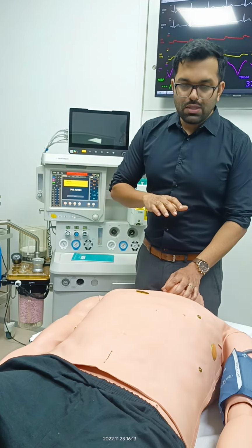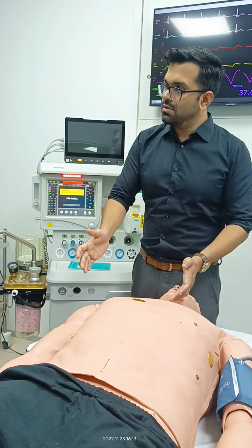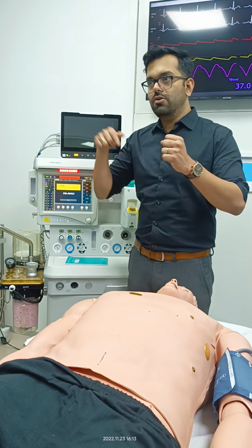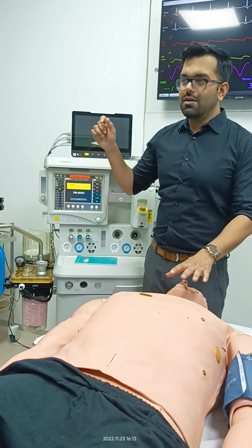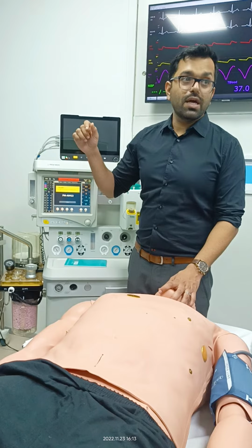Okay. So once muscle relaxant is given, we have given due time for the onset of action. Now your patient is ready for laryngoscopy. Laryngoscopy done, tube inserted, tube checked. How do you confirm the endotracheal placement of the ET tube? Auscultation or X-ray. X-rays, yeah.